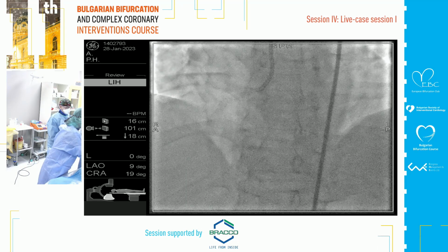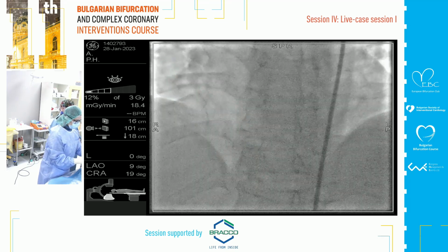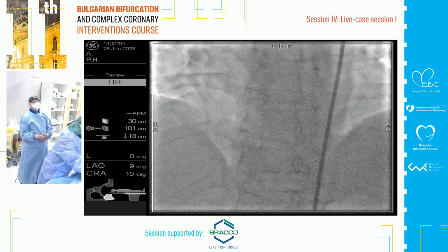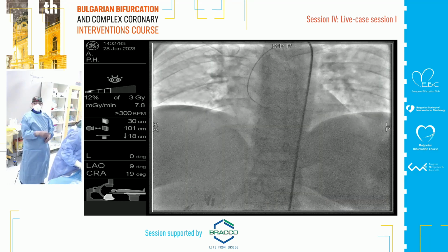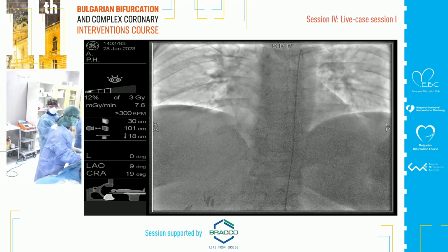where we have to do another IVUS because there is another ostium. So we still see ostial disease sometimes, an LAD disease. I remember cases with ostium right, ostium left, ostium renal, both renal, which is, I don't know if it is a specific disease or not. Maybe a special composition of genes, ostial genes.